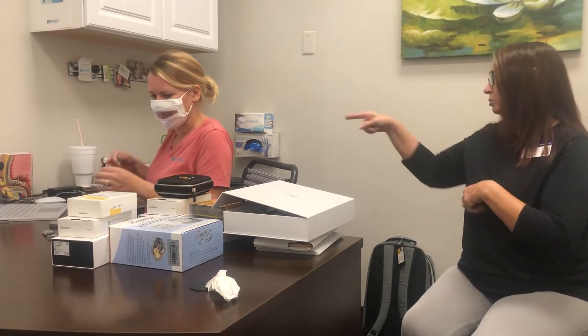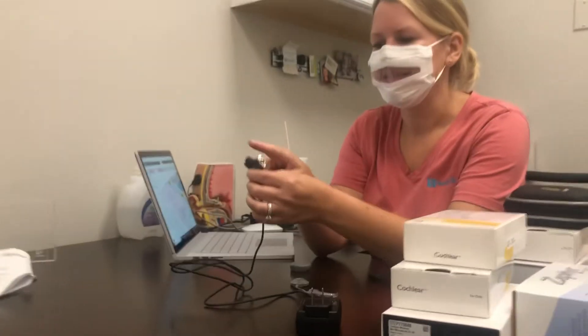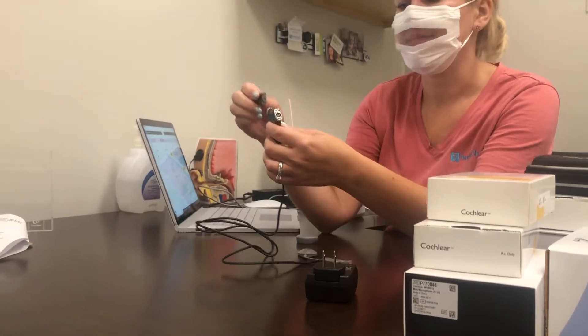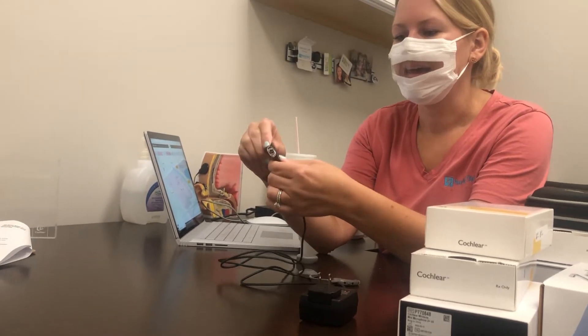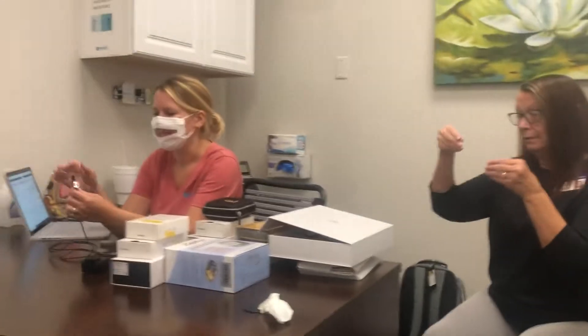Let's talk about the Nucleus 7 first. I'm going to show you with one of my batteries so I can leave yours on the charger as long as possible. This is your charger — you can put two batteries on here. The battery twists on with a quarter twist: you line it up diagonal, twist it, and you'll notice there is an indicator tab right here that will go at the top.